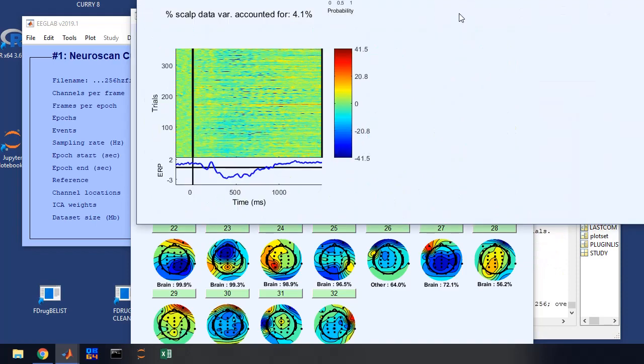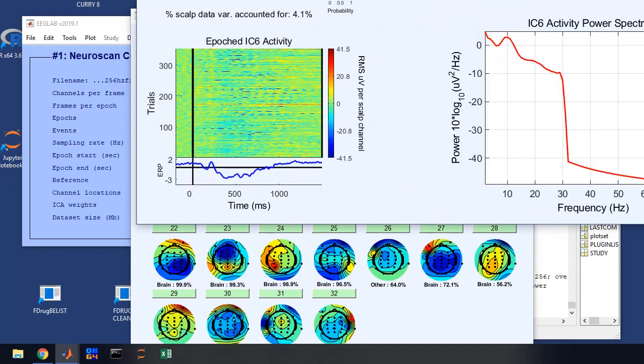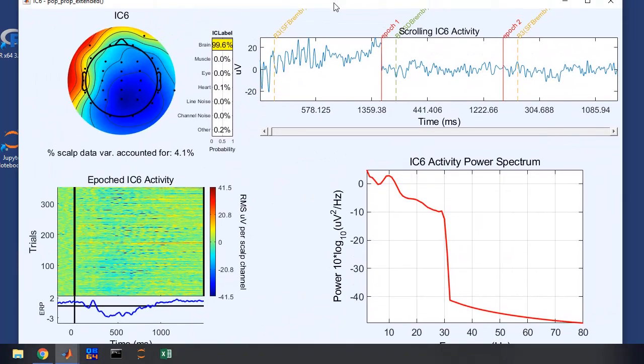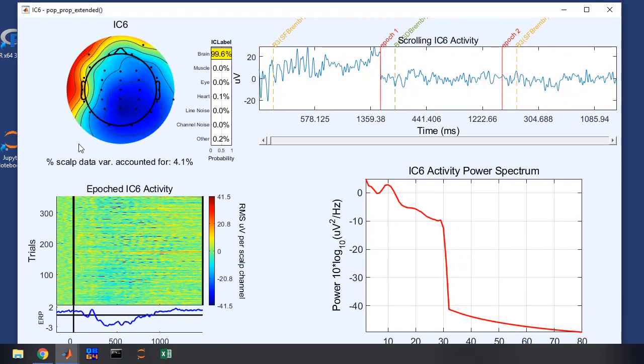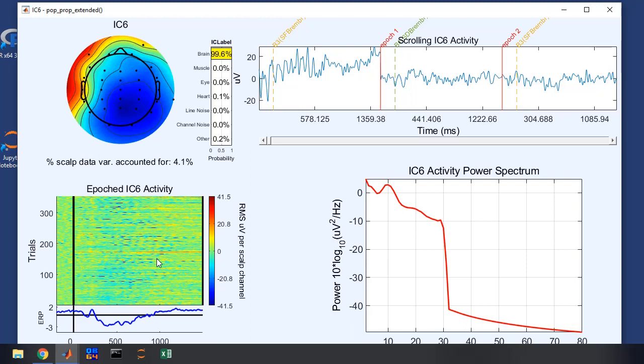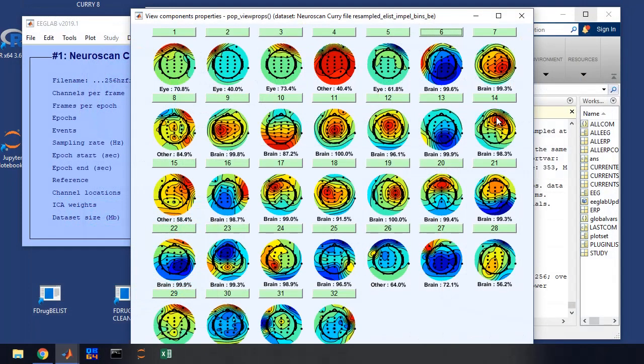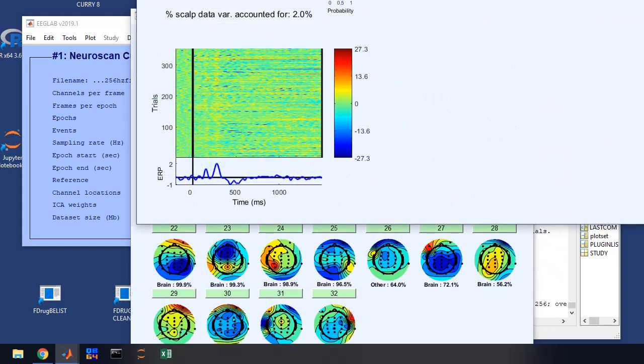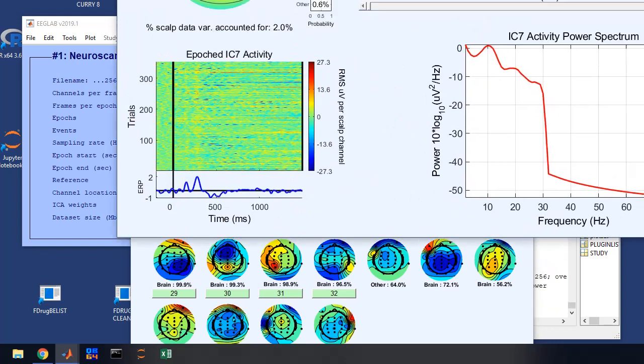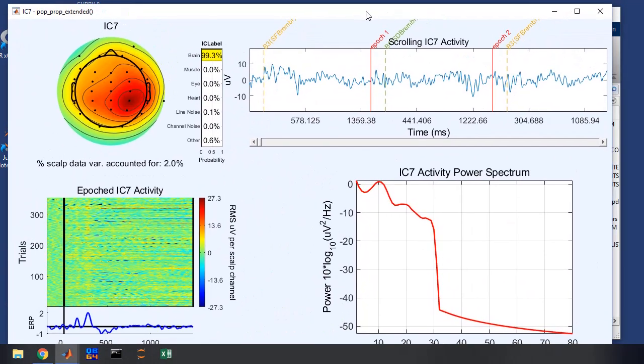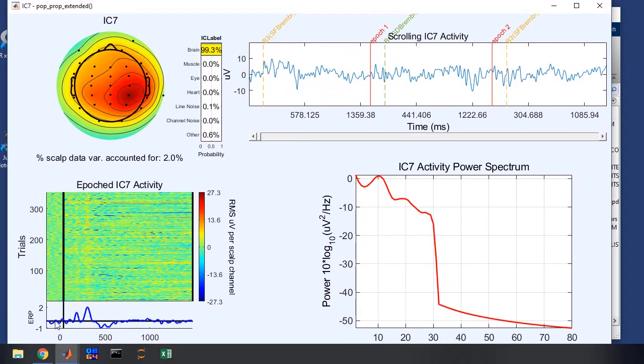And then let's look at a brain component just so you can see what a brain component looks like. So here's its distribution. Here's the ERP for it. And you can see that this is a nice scattered sort of plot that you would expect for an ERP across a lot of trials, not just a lot of times artifact will show up. It's just one clear band and the rest of the time it's not there. So that's good one brain. I'll show you another one. We'll look at seven. And we'll keep seven. That looks like a pretty good ERP there.